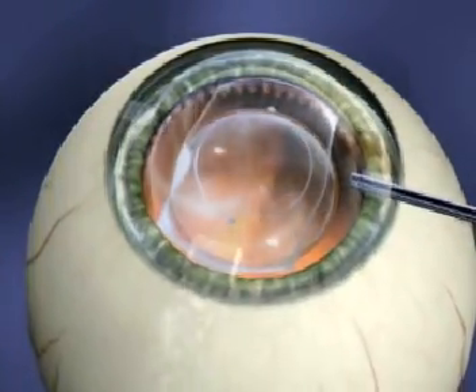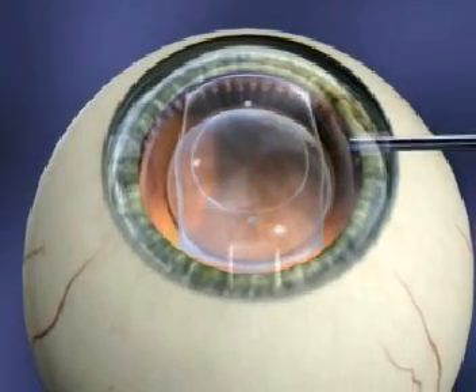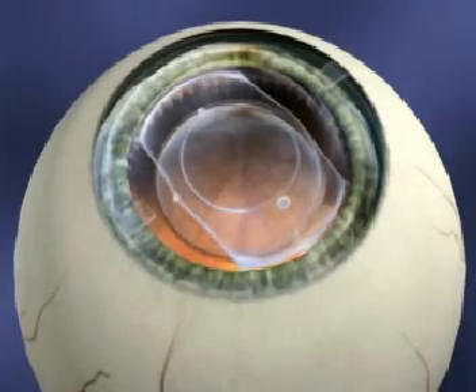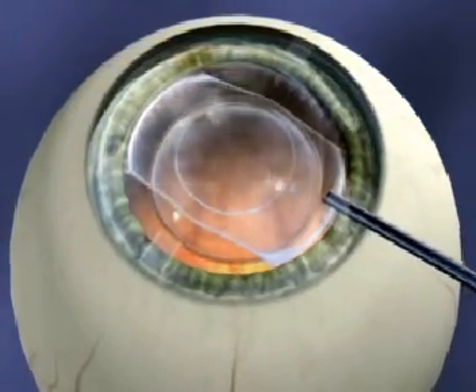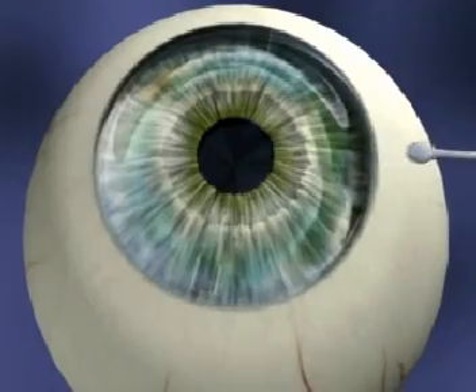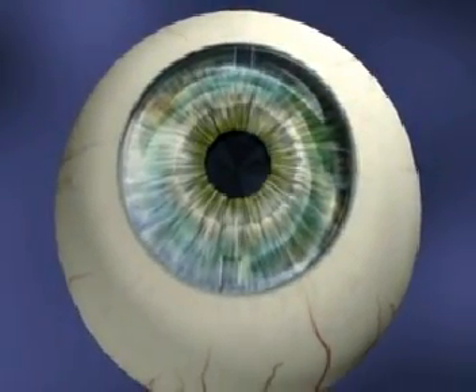Never depress the optic itself — this is the thinnest part of the lens. Thoroughly remove the viscoelastic by irrigating the anterior chamber with BSS through a 27-gauge cannula with slight incisional pressure. Thorough removal is a critical step to avoid early post-op intraocular pressure spikes. After confirming that the footplates are behind the iris and that all the viscoelastic has been removed, constrict the pupil with Miochol.